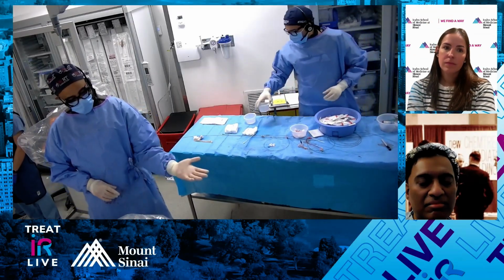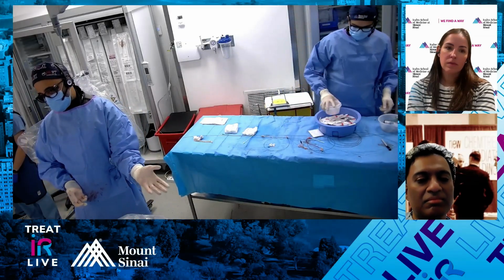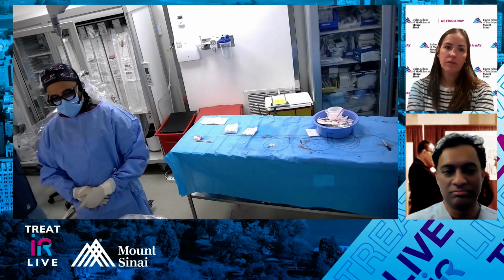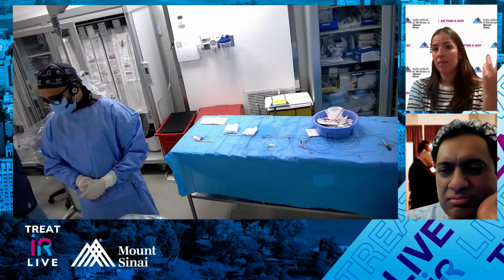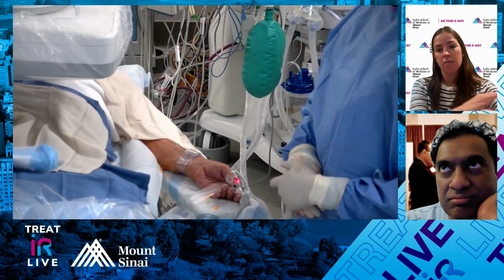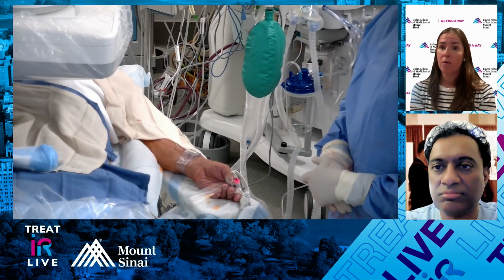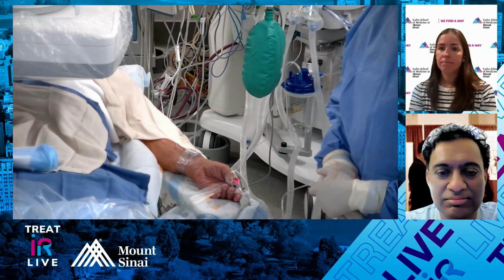If his hand is turned palm up, with a snuff box, from a positional standpoint, you can leave the hand in a more neutral position. We haven't used it a lot, so we didn't find it helpful. A case that comes to mind is a patient who has a tumor and can't really rotate their arm, and I want to go at the lateral. That's when I've used it. And there are specific closure bands for that. You can't use a TR band for that; you have to use something else.